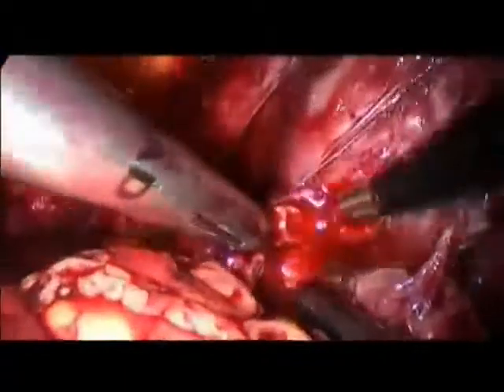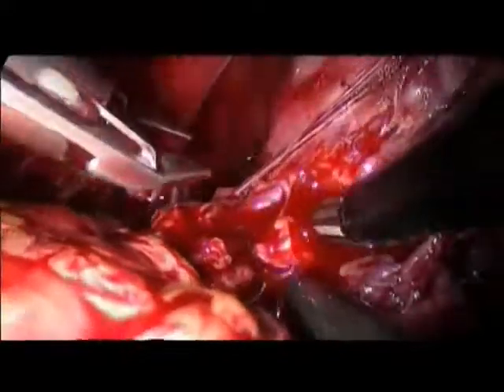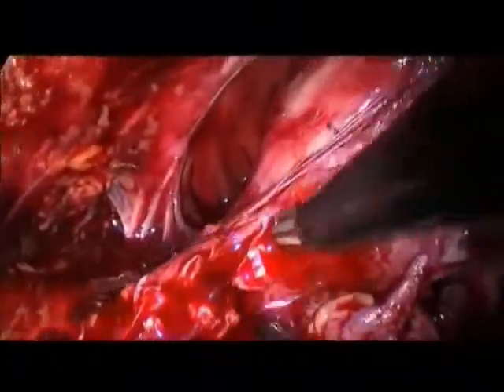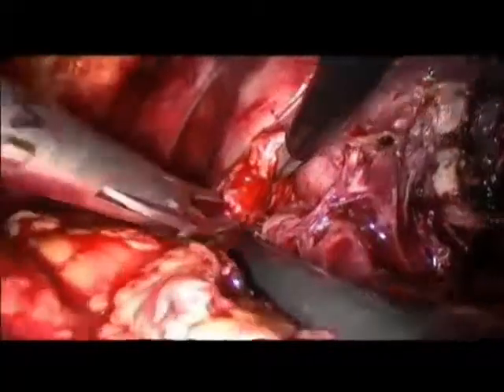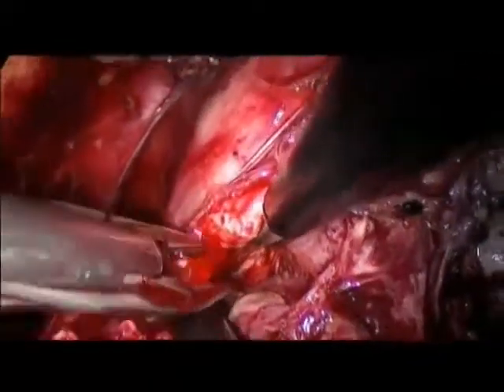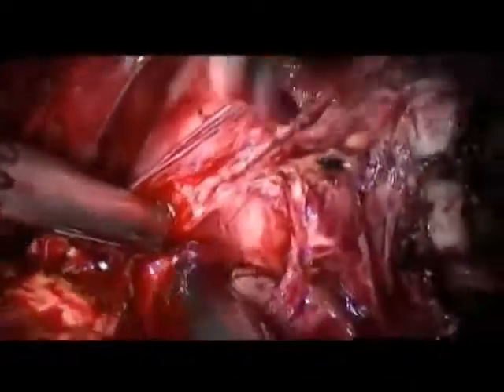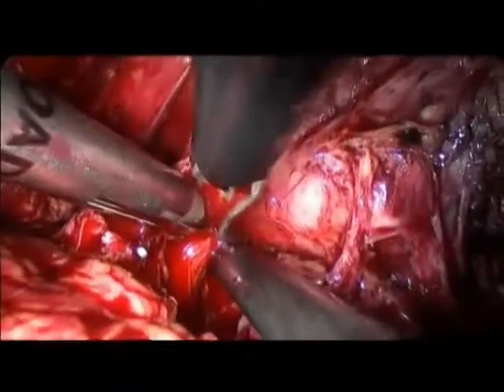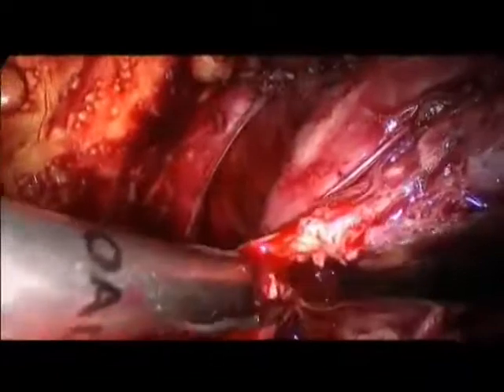about erectile preservation at 49, so that we have to negotiate a surgical compromise between a cure and preservation, so that in this case I think it's an indication for interfascial dissection progressing on both medial and lateral aspects of the upper attachments until the bundles fall down laterally.